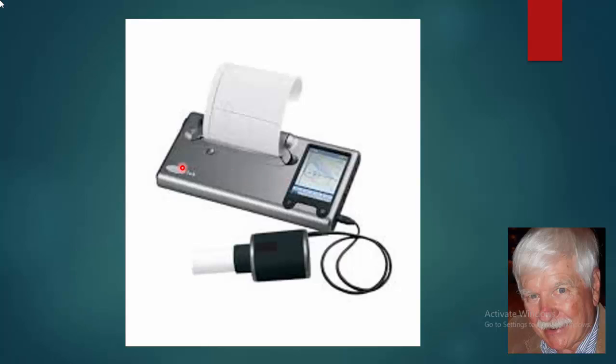This is a little spirometer. See, it's very compact. Here's where you breathe in and out. Here's where it's recorded, and this part of the unit is actually going to measure it, and it also gives you a printout. That's a handy little spirometer. I like that. Convenient, portable, lightweight.